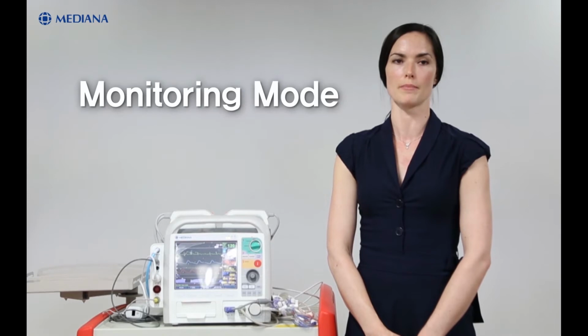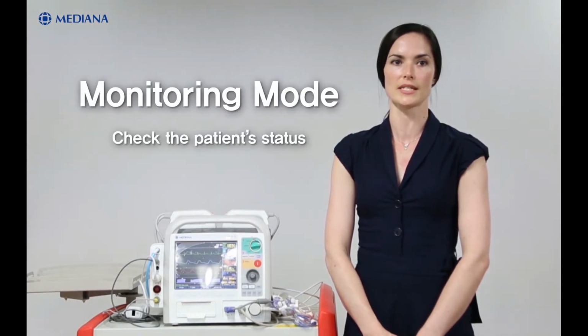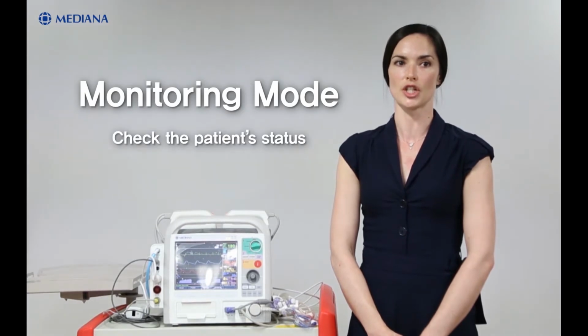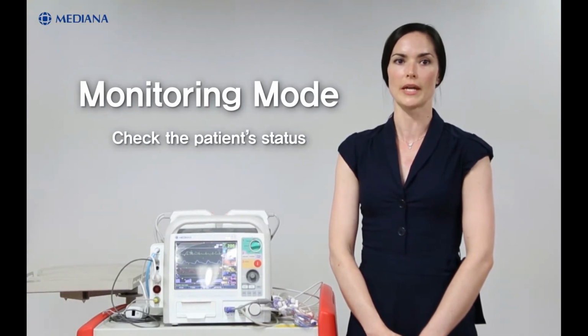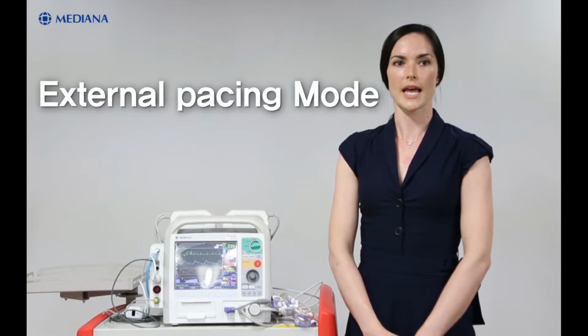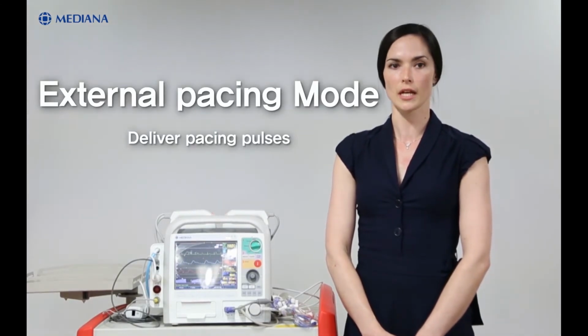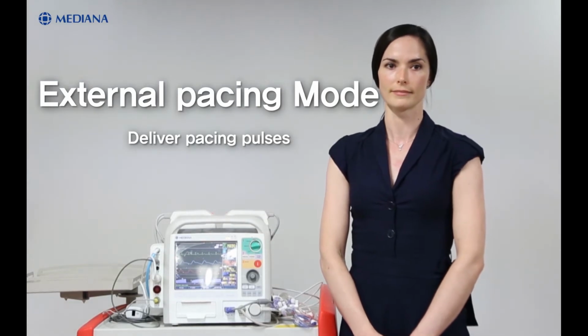D500 has a monitoring mode, so you can check the patient's status with 3, 5, or 12 lead ECG and other vital signs, depending on your options. And external pacing mode is used to deliver pacing pulses in either sync mode or async mode.